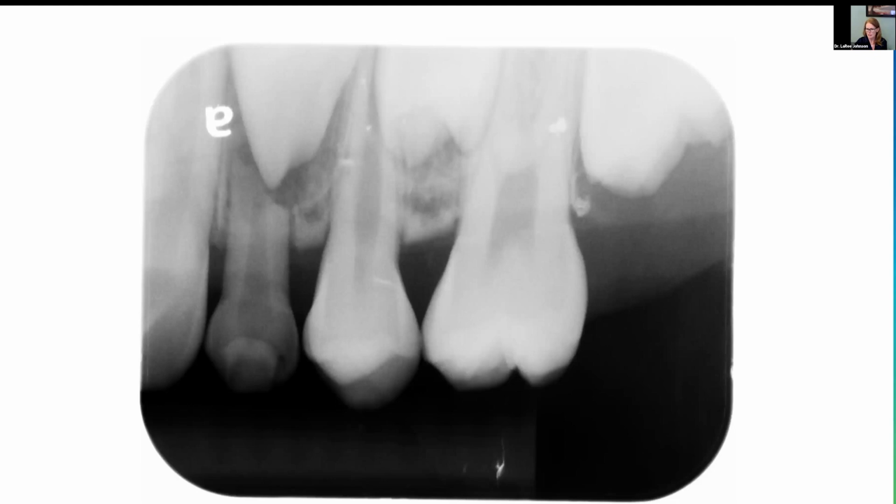All right, let's see. I've shown this case before, but people frequently ask me, can you show me taking out permanent teeth? I really want to see what that looks like. So this friend made the option. This is a private pay family. We kept referring to ortho due to this impacted canine, and finally they're like, we just can't do this. What else can you do for us? And I want to unpack the way this looks on this child.